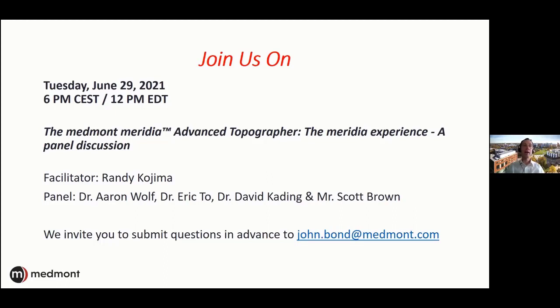Sure. So again, we've had some issues initially in terms of just the time to get things started and lined up, so the instrument recognizes that it's time for that double blink. But with the newer software, that has improved. And I know Medmont are committed to improving their software where they get clinician feedback. So hopefully that will be better for you in future iterations of the software with that current hardware that you have already. Yeah, great.